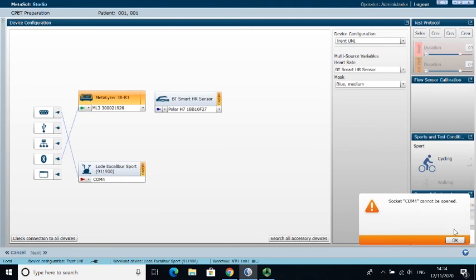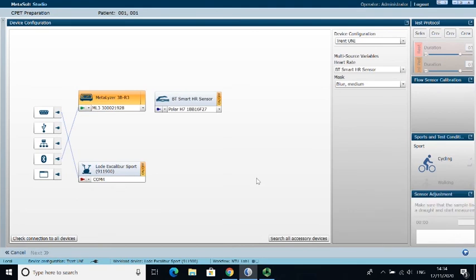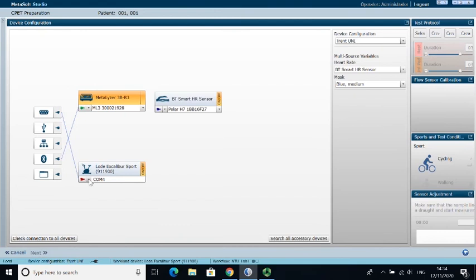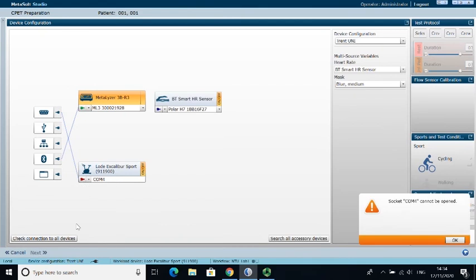So it's worth being aware of this side of things, because this is the important setup phase, which allows us to relax when we're actually taking the measurement and just concentrate on talking to our participant and looking at the test and seeing what's going on.